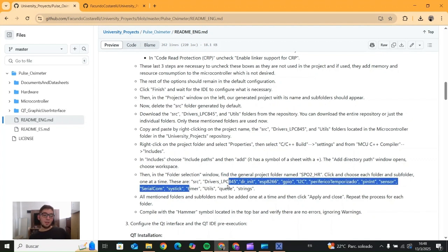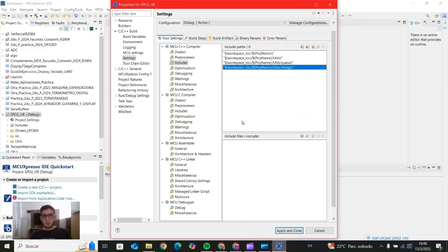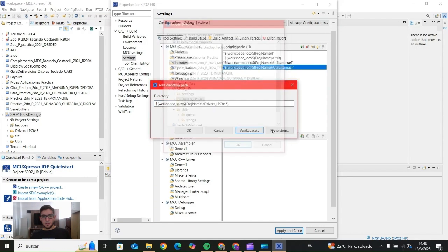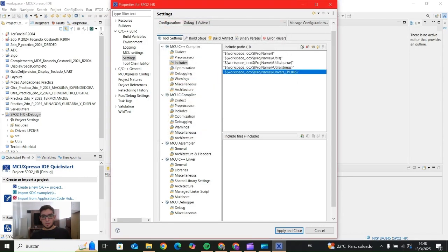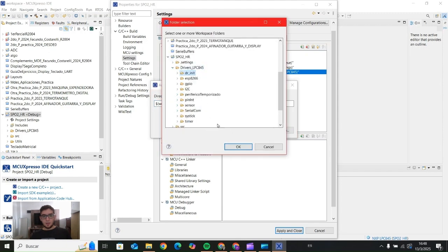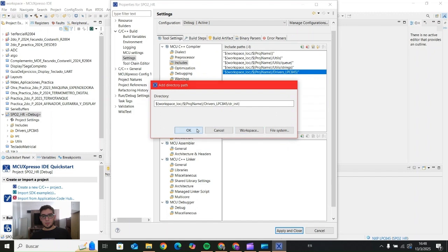So I'm going to add every single folder one by one, and subfolders. Well, let's continue with this. Then we add the drivers. Yeah, drivers, and okay, DRINIT.